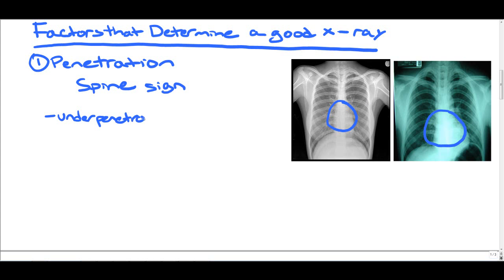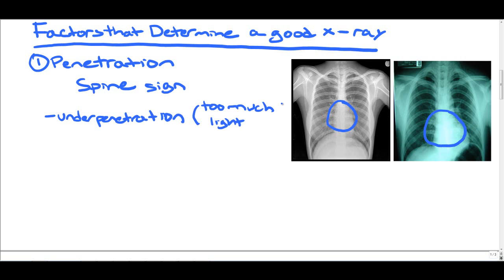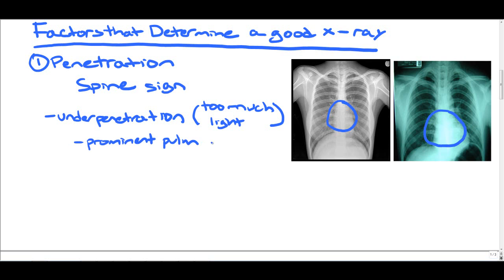So what is underpenetration? Underpenetration is when you have too much light in the x-ray. The reason why it's important to identify x-rays that are underpenetrated is that it can lead to prominent pulmonary markings. And though a patient may have a normal x-ray, if it's underpenetrated, this can let you think that these prominent pulmonary markings are due to either pulmonary fibrosis or heart failure.